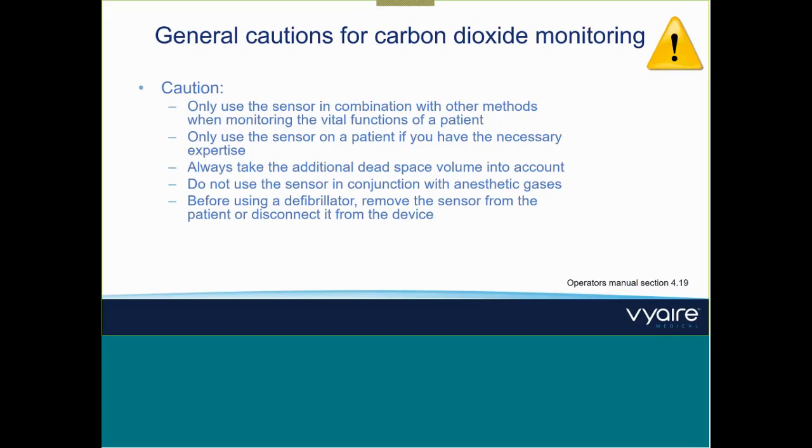When you resuscitate a patient, take the CO2 off and disconnect it from the device. Sure. And this is something I always come across: the patient has a very funny CO2, I have to adjust the ventilation in non-invasive. It's measuring the exhalation, but when there is a high leakage and 80% of the inhaled tidal volume is getting out beside the mask, your CO2 measurement will be highly impaired. So always take into account, when using Sidestream or mainstream, that the leakage is taking out CO2 already. So those values might not be perfect, or most likely are not perfect. Only if you can manage to keep the leakage very stable might you use CO2 measurement, but often it's not working very well.